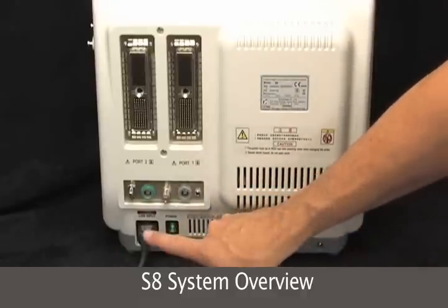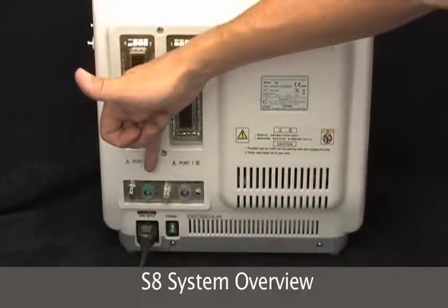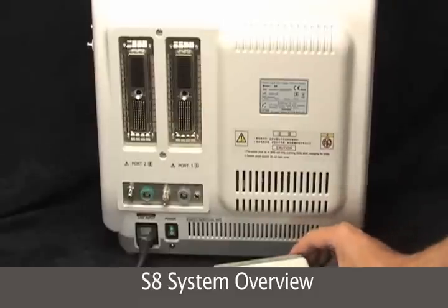Main power and this is where the power cord goes in. We have a ground, ECG leads, video in and out, foot switch, and a printer port.